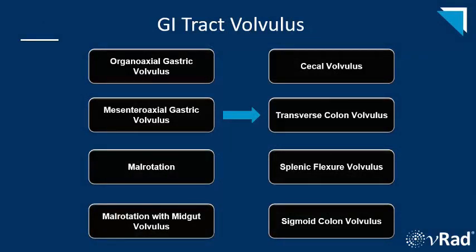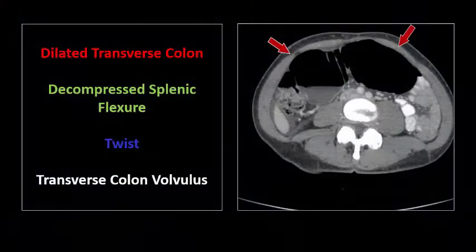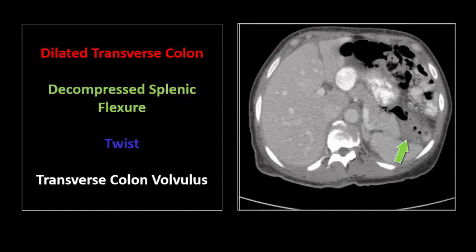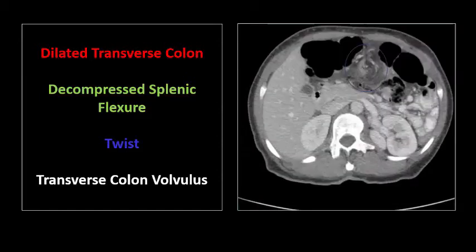Colonic volvulus can occur anywhere, so we're moving on to the transverse colon. Here we see the dilated transverse colon with an air-fluid level, the decompressed splenic flexure, and the twist of the mesentery in the central abdomen, compatible with transverse colon volvulus. Although it's the rarest site of colonic volvulus, accounting for less than 5 to 10 percent of cases, it is associated with the highest mortality. Unlike cecal and sigmoid colon volvulus, there's no classic plain film appearance, so CT is usually your one and only chance to diagnose it.